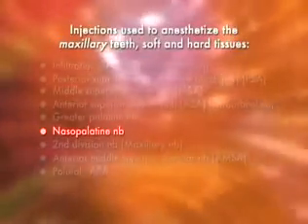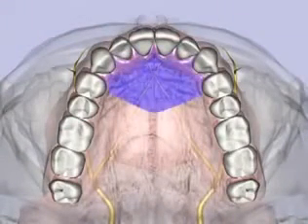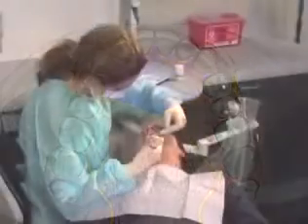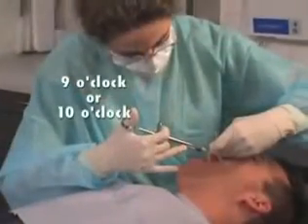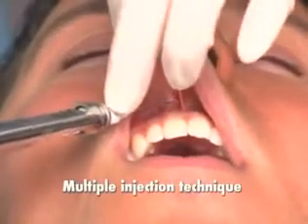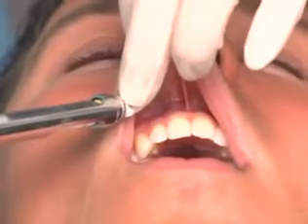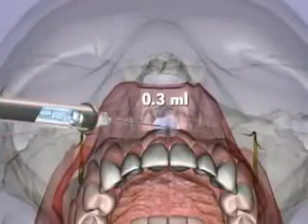The nasopalatine nerve block provides anesthesia to the anterior portion of the hard palate, both soft and hard tissues, from the mesial of the right first premolar to the mesial of the left first premolar. For the nasopalatine nerve block, sit at the 9 or 10 o'clock position facing in the same direction as the patient. In the multiple injection technique, the first injection is an infiltration into the labial soft tissues between the two central incisors; 0.3 mls of anesthetic is administered.